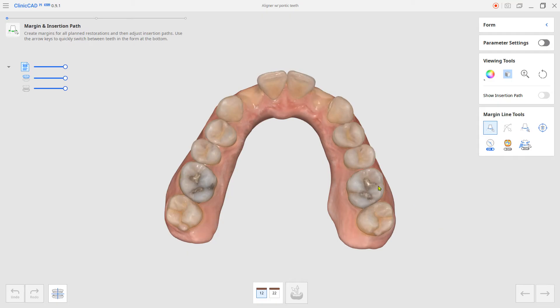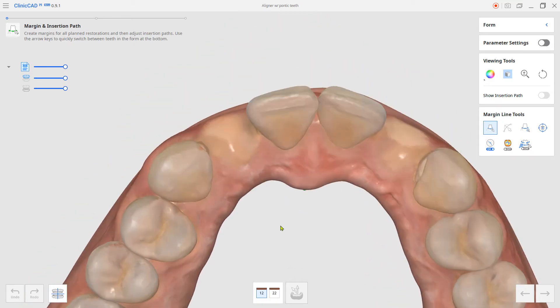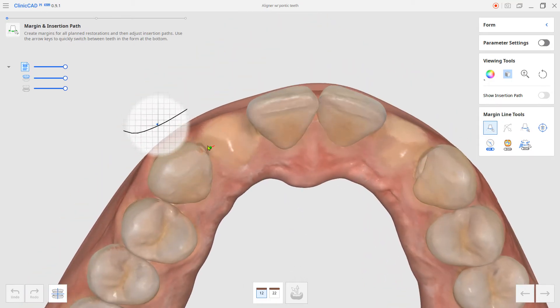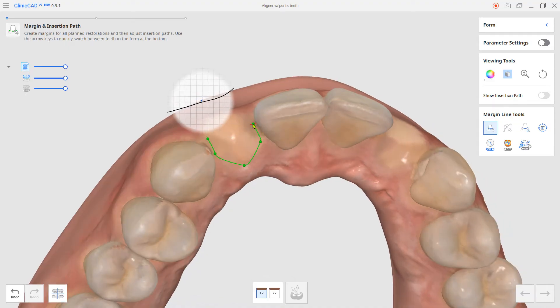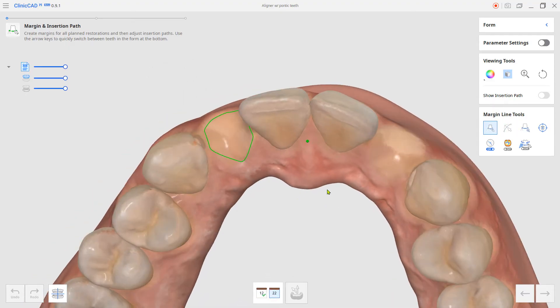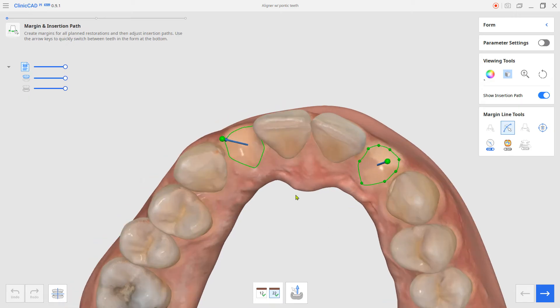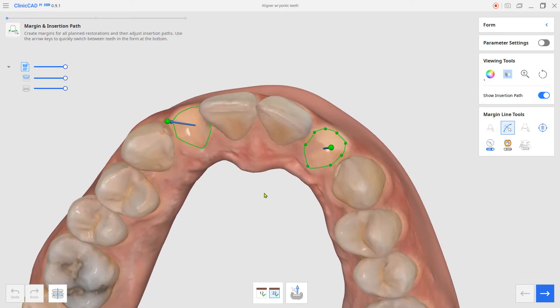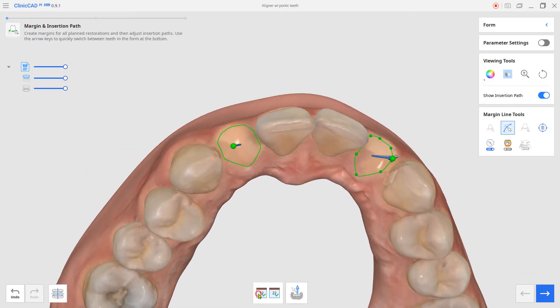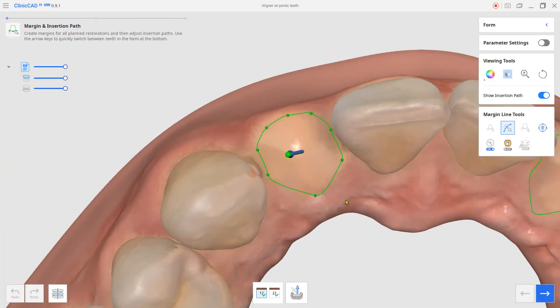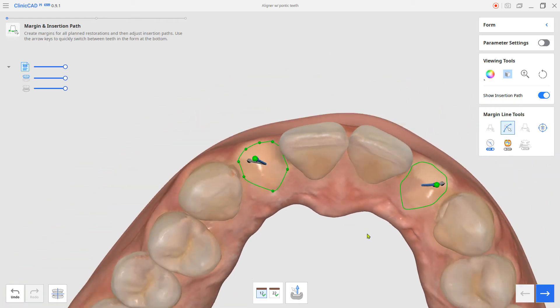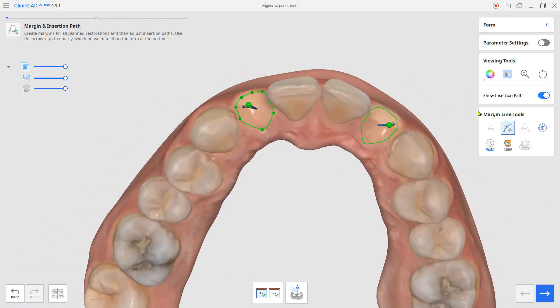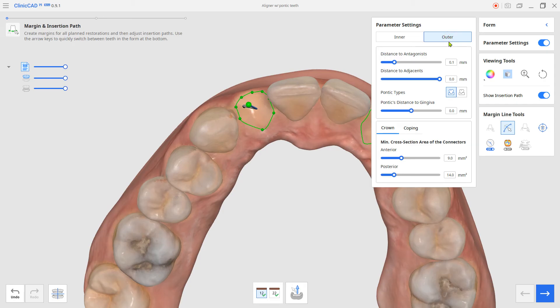Choose the prepared data mode and assign the scenario maxilla and mandible for the upper and lower. Set the pontic's margin and insertion path. Before moving to the next step, activate the parameter setting from the right and verify the right settings on the pontic's.